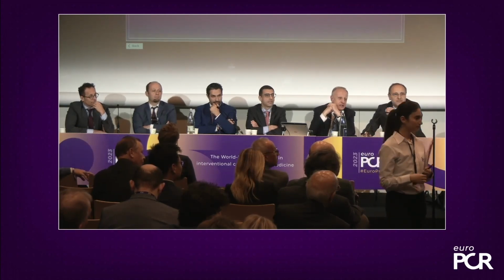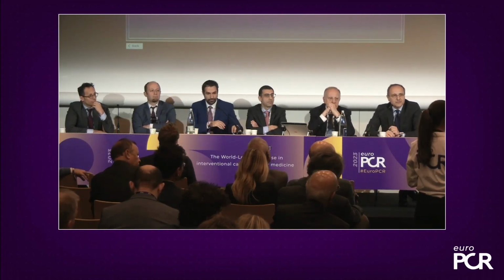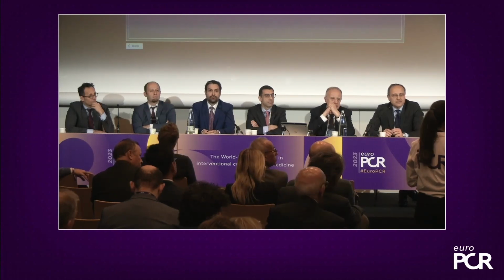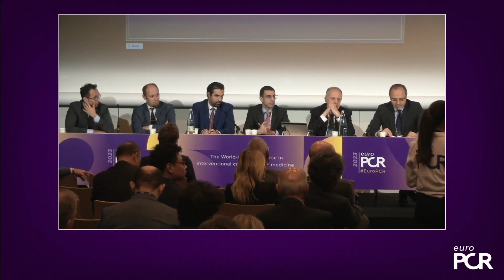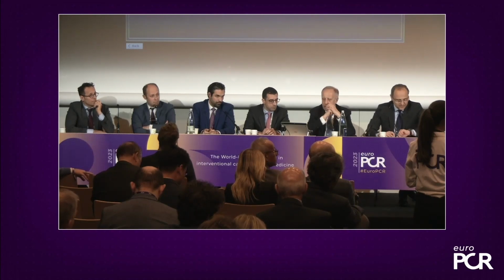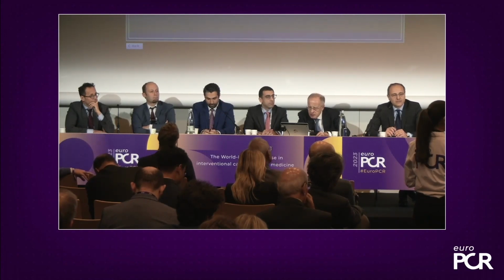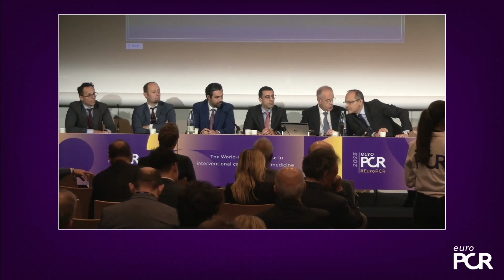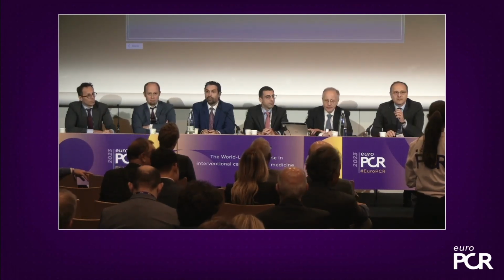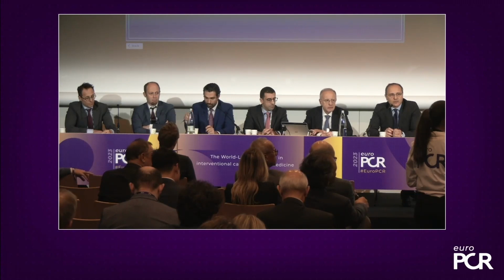In our cath lab, it depends on the patient and on the lesion. If you do the pullback, because we have severe diffuse atherosclerosis, I think it is mandatory to do the pullback again after you have put in one, two, three stents. In these cases, we do it regularly, and we stop only when we don't have any more to treat. So in these cases, I think it is mandatory to do physiology again on the coronary artery. And I think it is also better in this case to have a catheter, to do in and out.